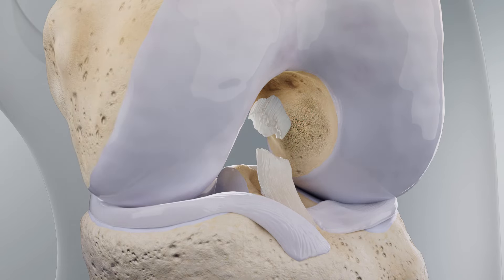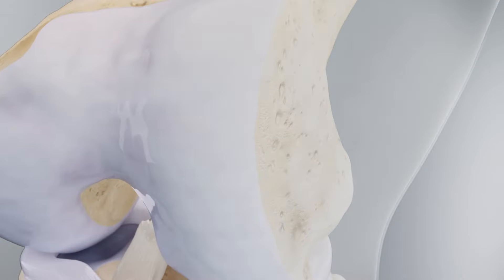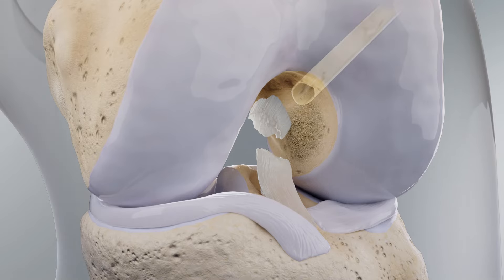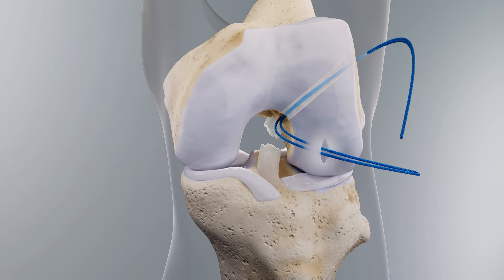The femoral tunnel should be prepared by drilling the appropriate guide pin at the central anterior edge of the femoral ACL footprint. Create a lateral skin incision distal to the pin and down to the bone. Follow this guide pin with the corresponding fixation button drill and reamer. Place a passing suture through the femoral tunnel.